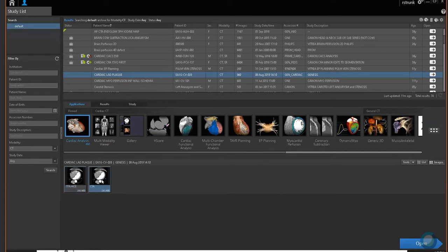In my case I have two phases, but if they reconstruct maybe a 60, 65, 70, or 75, you can load over 20 phases if you like. You just select which phase you like and click on the bottom where it says Open. That will launch this one single phase into the cardiac CT application.